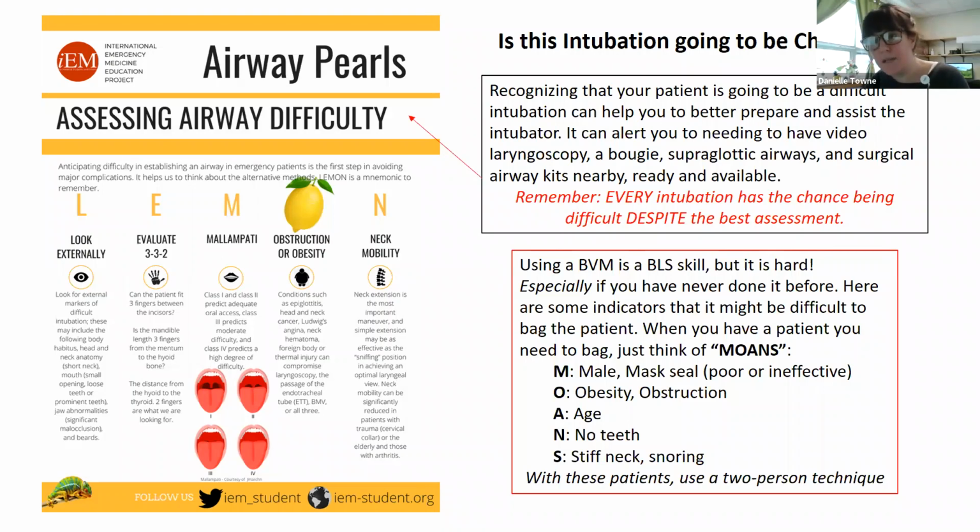A Mallampati is something that you might hear. And again, that's when you have the patient open up their mouth and stick out their tongue. And you want to see how many of the posterior structures you can actually visualize. And this might be one that you see a provider do if the patient is conscious and able to follow commands before they do an intubation.